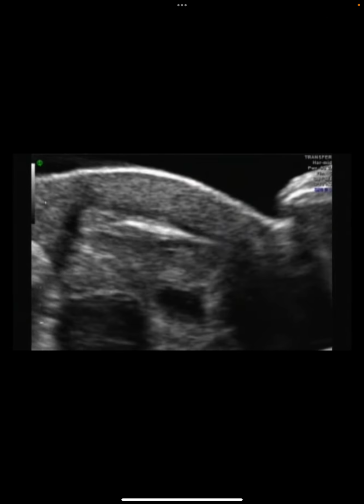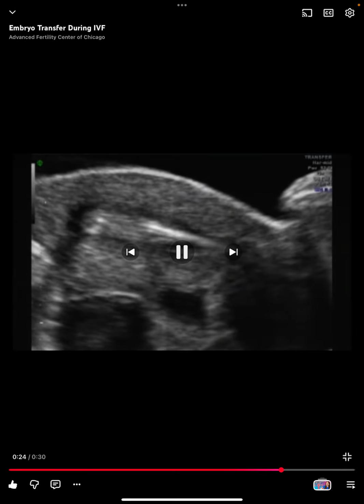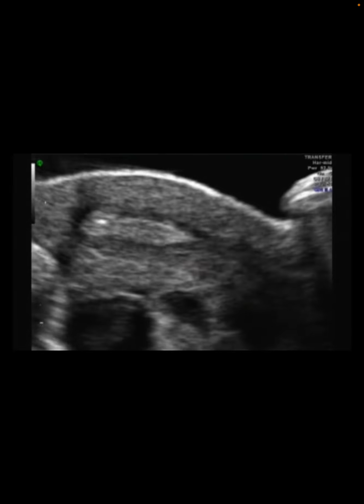If you see, it is almost 1 to 2 centimeter below the fundus. You should not touch the fundus, okay? Then you will push the plunger so that embryos enter into the cavity. We see a flash of media containing the embryos coming from the tip. Then we slowly withdraw the catheter and it's done. That should do the trick.